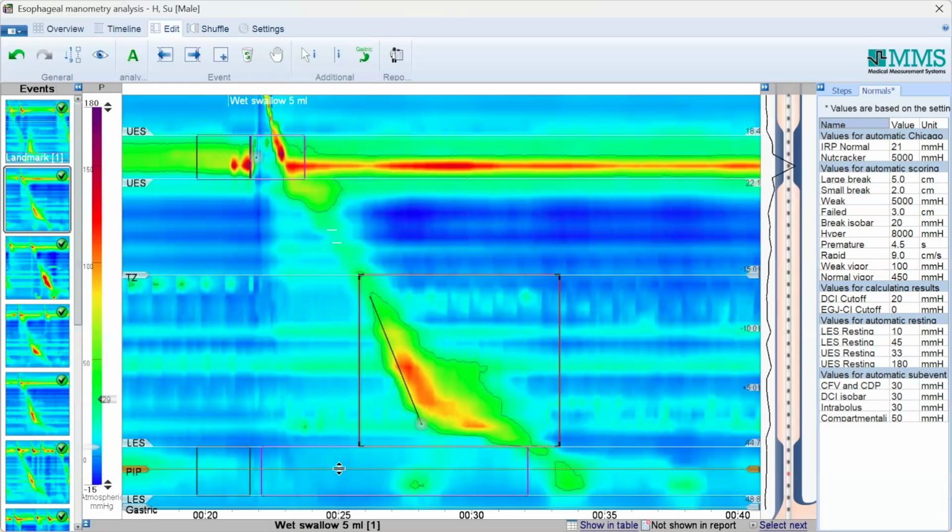I think this is the type that you can see. It usually makes achalasia type 1 or 2 or 3. It depends. But the note that I have to focus on is that again, if there is high pressure in the LES, the IRP is abnormal, and you can say that it's outflow obstruction, and there is peristalsis.